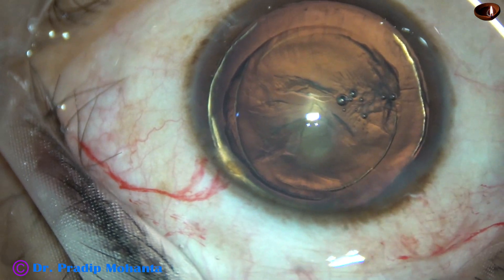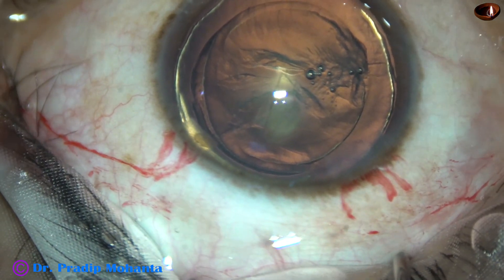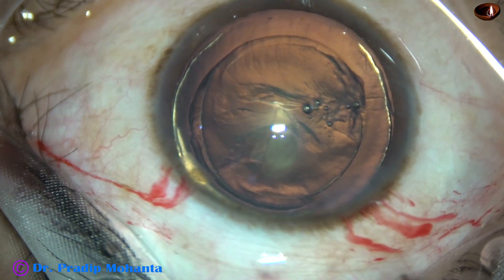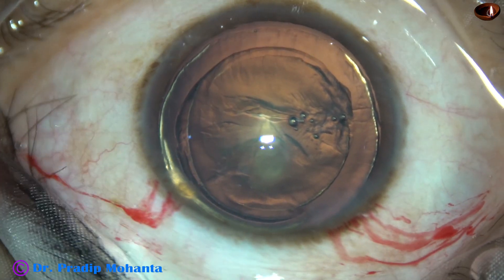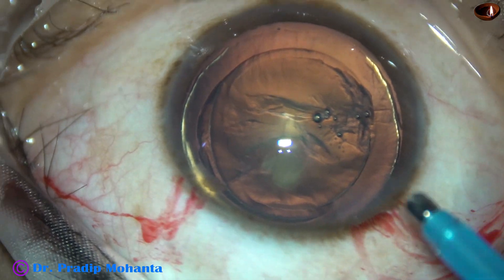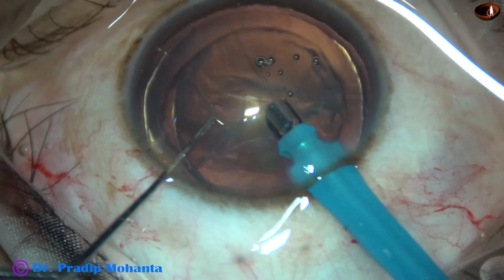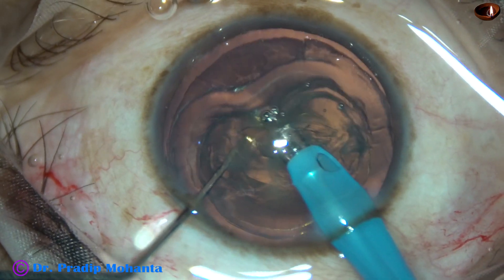Now it is time to introduce the phaco needle into the anterior chamber. The bottle height has been reduced to 80 cm, the vacuum has been reduced to 250, the flow rate is 25, and ultrasonic energy is only 40% in this case. The intraocular pressure is being kept on the lower side.